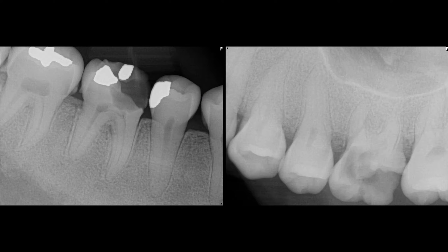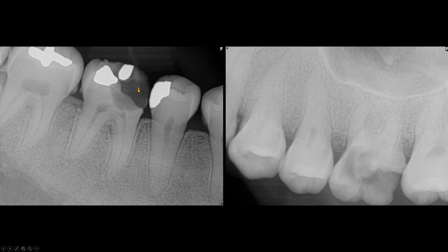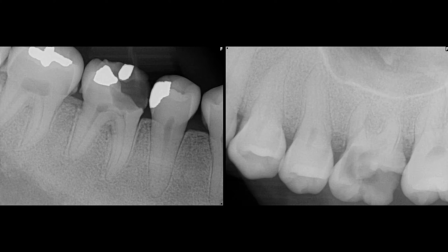Going back to the radiographs, you can see the large carious lesion of the maxillary left first molar and the mandibular right first molar. You can also see the restorations on the mandibular right second premolar and the second molar. In this video, we are going to skip the carious lesions as we focus on the features of renal osteodystrophy.